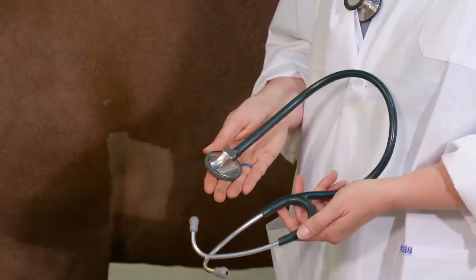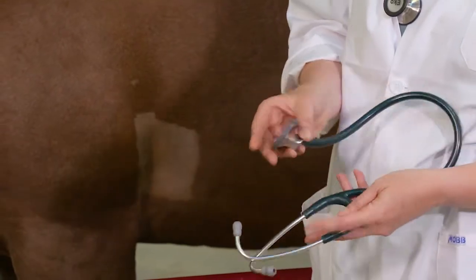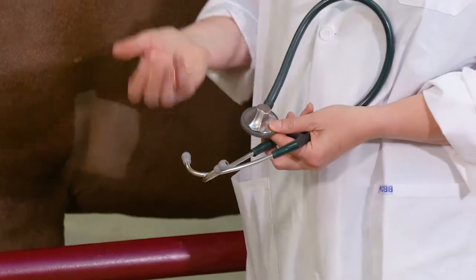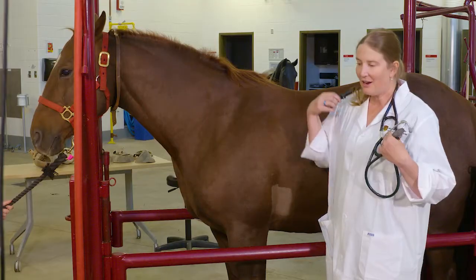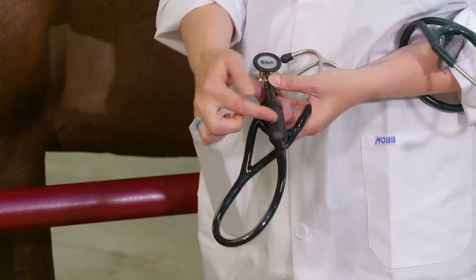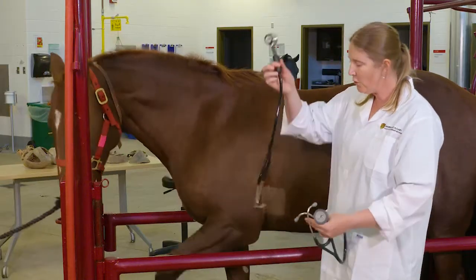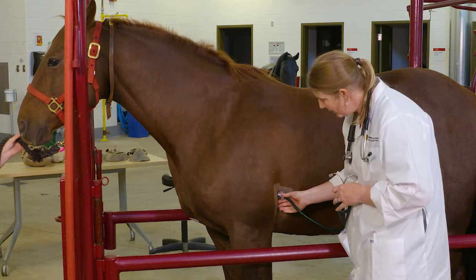This one here is one of my fancy cardiac stethoscopes — you can see it has a special way to hold on to it. You can get much cheaper stethoscopes to use on your horse; there are just human ones that you can get at a pharmacy. I also have a digital stethoscope here, which has a recording piece that actually sends information over to my phone by Bluetooth. When I'm listening to the horse's heart, I don't just listen over one spot.